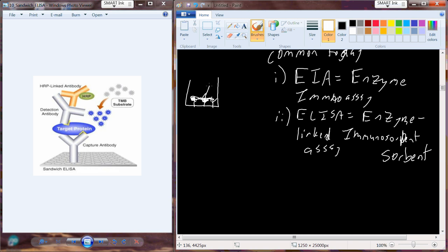So you're setting up this situation where you capture your hormone of interest or you capture another molecule. And so there's kind of this inverse relationship. The more hormone of interest you have, the less of this other detection molecule you have, or vice versa. And so then your detection antibody comes on. Nothing probably is going to bind here, but it'll bind to the other molecule. And then there's an enzyme that's attached to that second or even sometimes a third antibody. Is this kind of making sense?